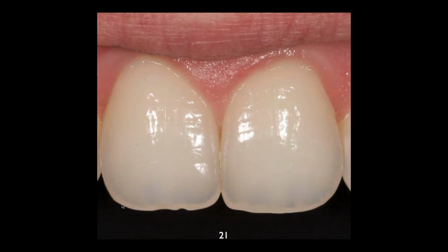So what you want to do when you photograph these teeth and bring it into your computer, if you have Photoshop or anything like this, is go to your contrast slider and turn the contrast up, and you can digitally see these cuts a lot better. If you have too much light, you can't see these. So it helps you determine where you place all these special effects by just moving the contrast slider left or right. I don't know which way it would work in each software.